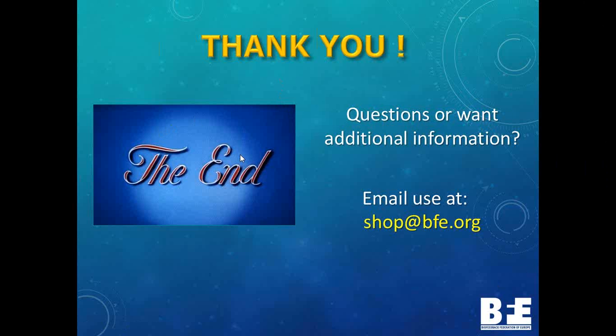Question from Nancy. Will the update include instructions regarding how to do the 5-sensor hookup for the ClinicalQ? Yep. I already have the photos prepped. I already have the description written down, so the software manual will describe everything about using the ClinicalQ assessment if you're using 5 sensors instead of just 2. And so that'll all be written down there, and it'll be hopefully easy to follow. And if it's not easy to follow, well, you can send BFE some emails, and then they're going to yell at me, and I'll probably have to make corrections or meet with you to try to figure out what the problem is.